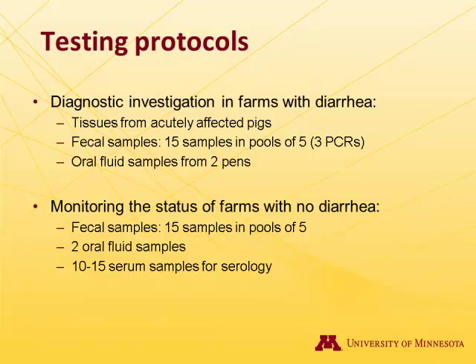But then another alternative would be to use fecal samples. And at this point, we think that we can work with 15 fecal samples in pools of 5. We feel comfortable with that pooling strategy. Maybe as we learn more, we will have to refine those recommendations.